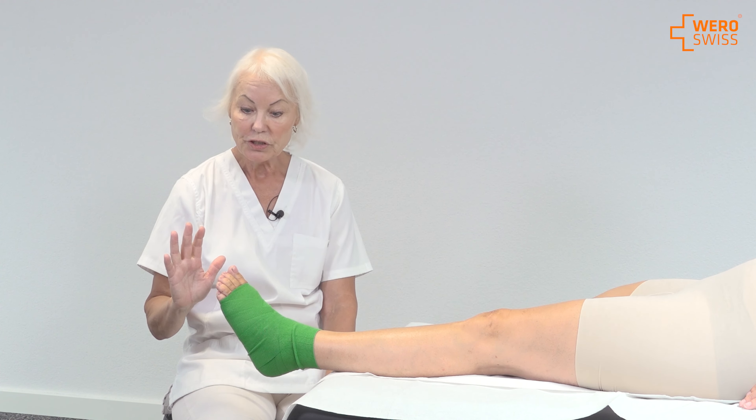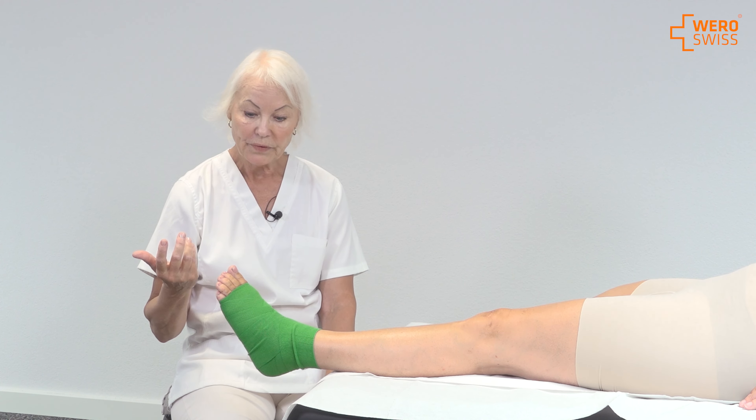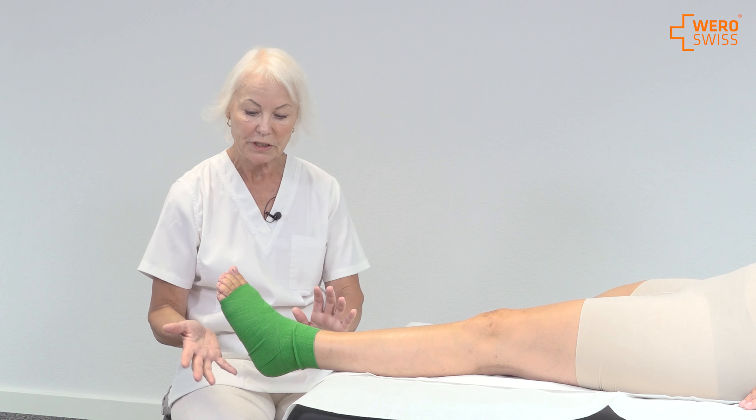Press the toe for five seconds to see that blood circulation starts again. Ask the patient if they feel any tingling, numbing, or discomfort. If it's discomforting, you have to take it off and redo it.